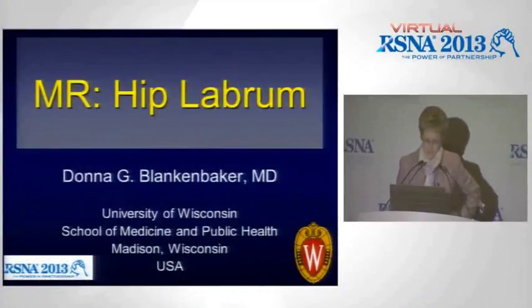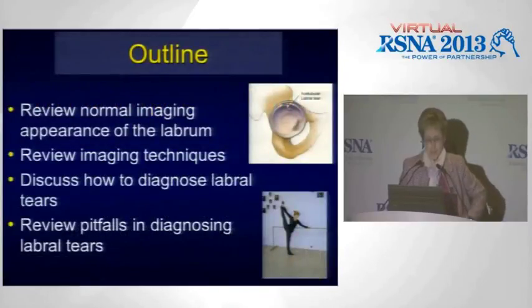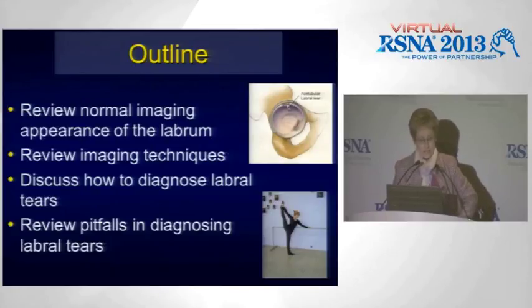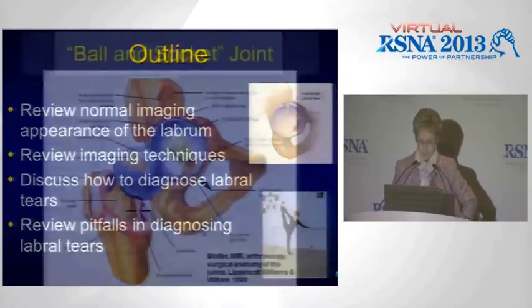All right, good afternoon. Thank you for all hanging in there. The topic that I was given was to discuss the hip labrum, so that's going to be the entirety of our discussion today. What I thought we'd do is review the normal imaging appearance of the acetabular labrum, briefly discuss the imaging techniques, and then move on to how to diagnose labral tears, and then wrap up with a discussion of the pitfalls in diagnosing labral pathology.